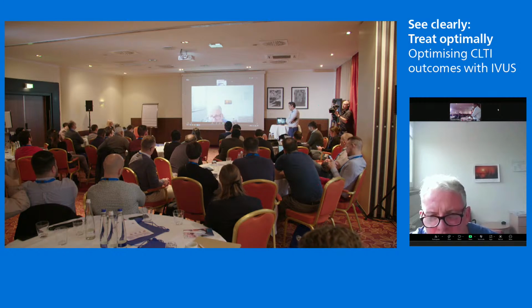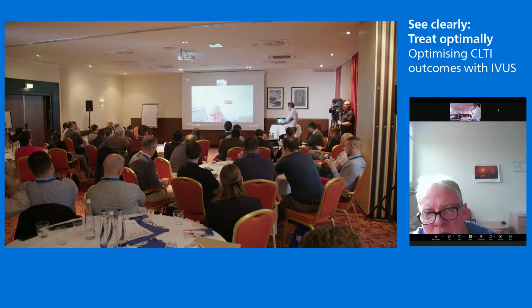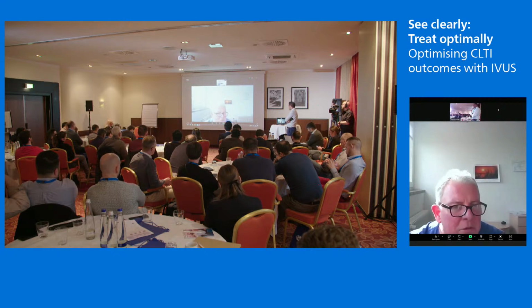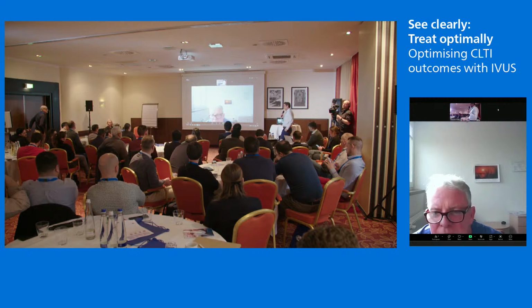But otherwise, Phoenix does calcium. Secondly, I would probably use the Hawk to do soft tissue, intimal flaps and all this, and maybe off-label even in stents, where you have to be careful not to proceed if you're on the stent struts. And then I would take the laser, because it's such a big, costly piece of equipment. So that's always to be thought about. Any other questions?